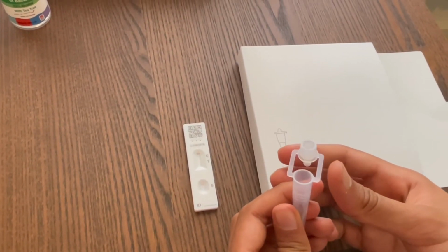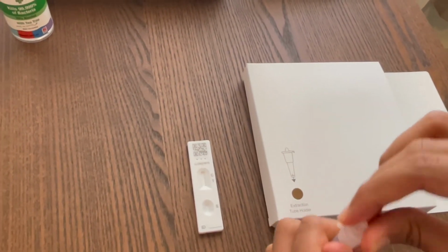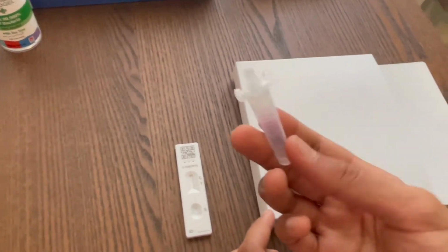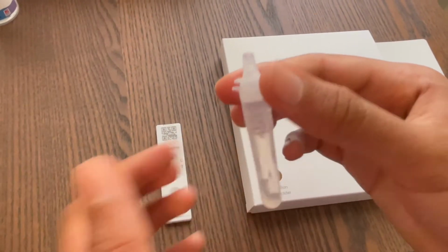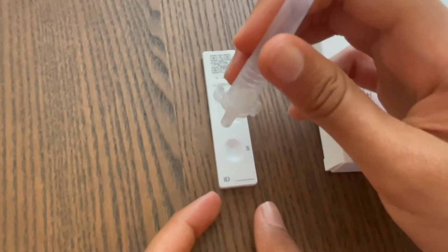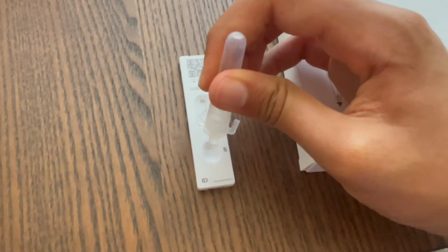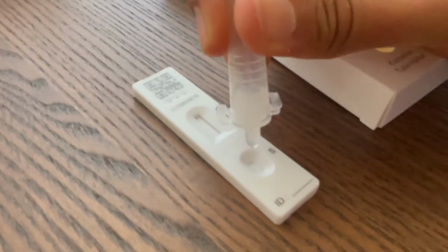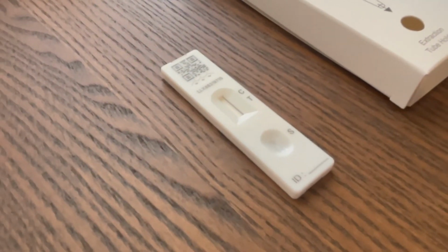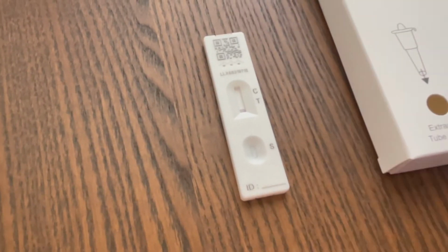Remember to press the cap tightly onto the extraction tube to avoid any leaks. Now, gently squeeze the extraction tube to place 2 drops of the liquid into the specimen well S on this test strip. Now, you have to make sure that you are dropping liquid and not an air bubble. That is important. Check the time and set a timer if you have one. Wait 30 minutes before you read your result.